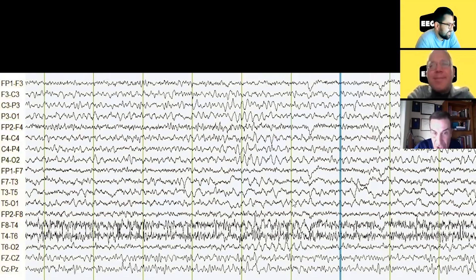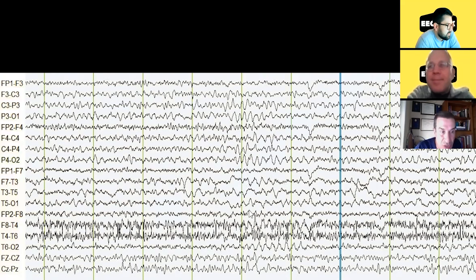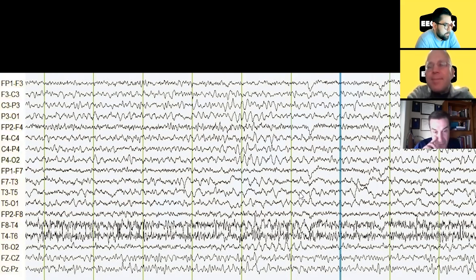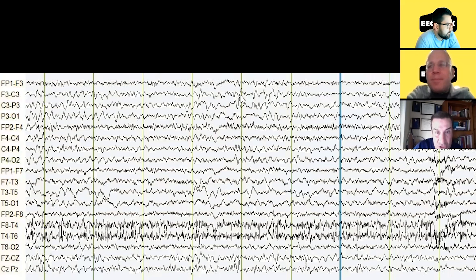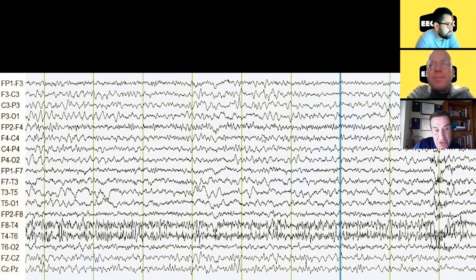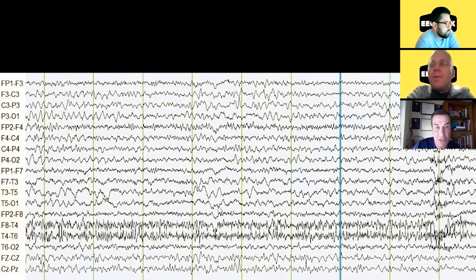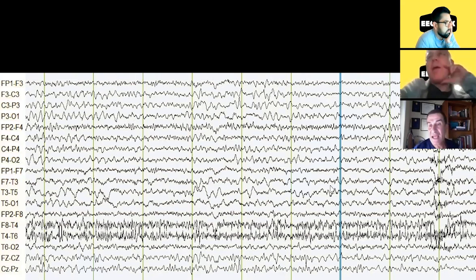Here in the same area — the left temporal region does appear to have some slowing and possibly an amplitude asymmetry compared to the right. But we are focusing on the phase reversals, and as we said, they mean *where* the discharge is, not *what* it is. You can see some here too — the central area has phase reversals. In themselves they don't mean much, but this is abnormal slowing in the left temporal region.